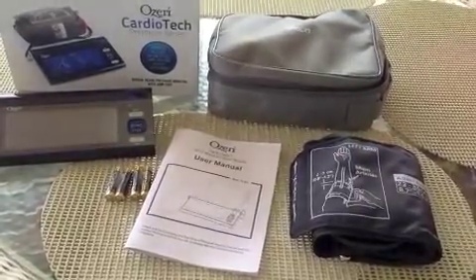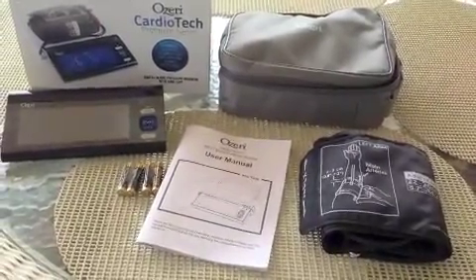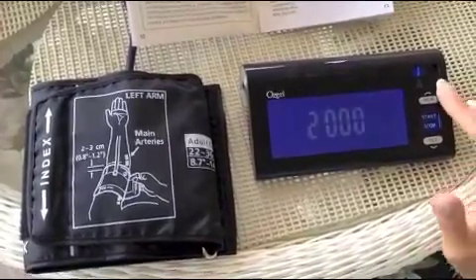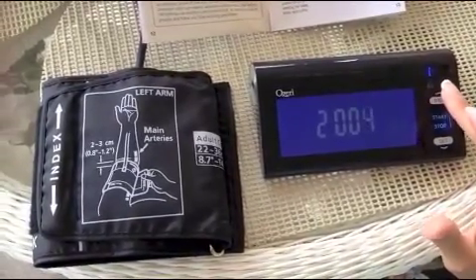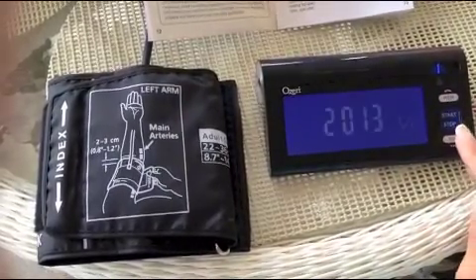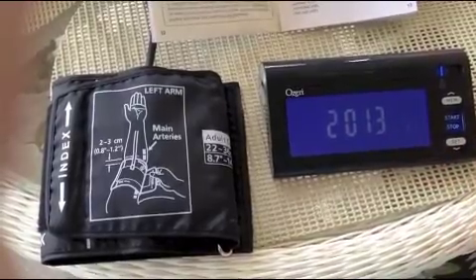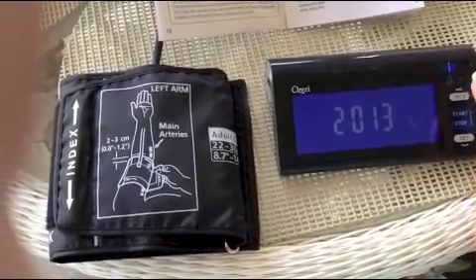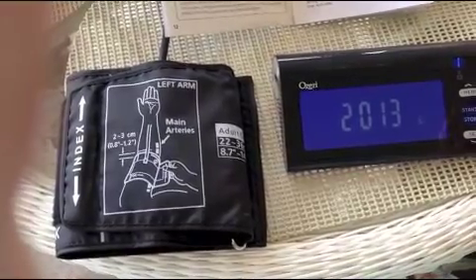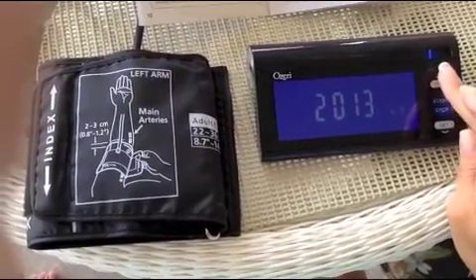You start by putting the batteries in. We're going to set the time and date — press and hold it, go up to 13. Once we got that set we're going to press set, it's going to advance to the month. It's the 6th month. Press and hold set, now we're going to do the day — it's the 16th.